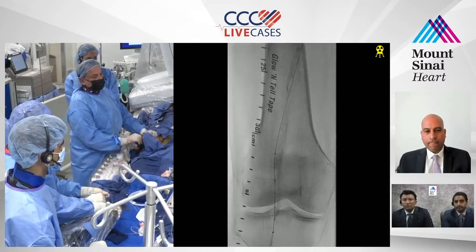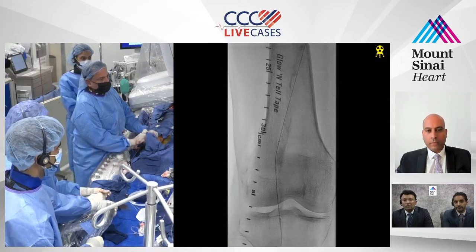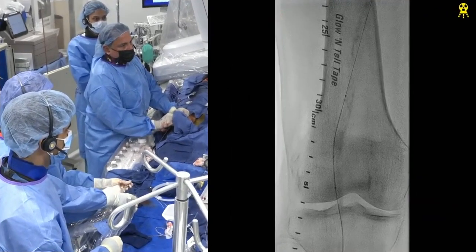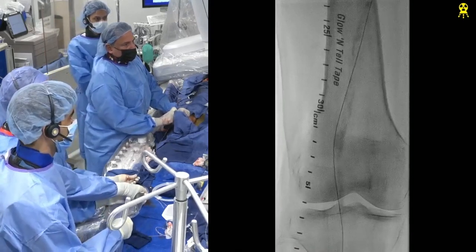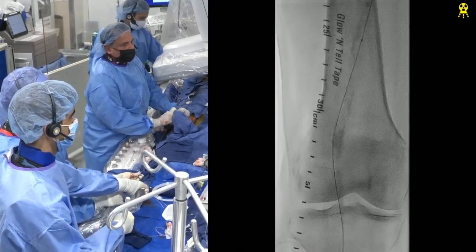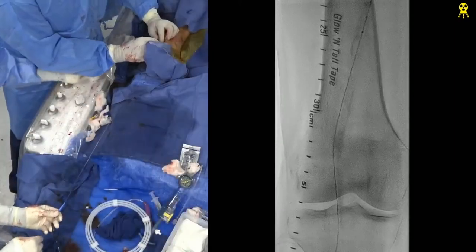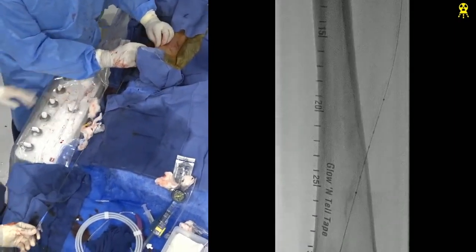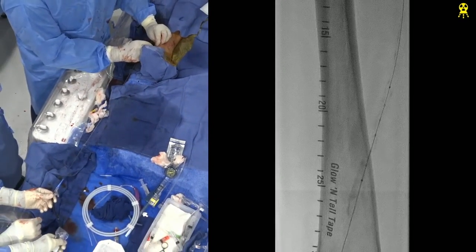Hold on, let me give him a reel. Okay. This is what I told you. The through and through is so important. Wow. Okay. One down, two more to go. I think it should go now. I'm praying. If not, we can balloon this segment again. Thankfully, you have that rail. No, we gave up the rail now. We gave up the rail, yeah.